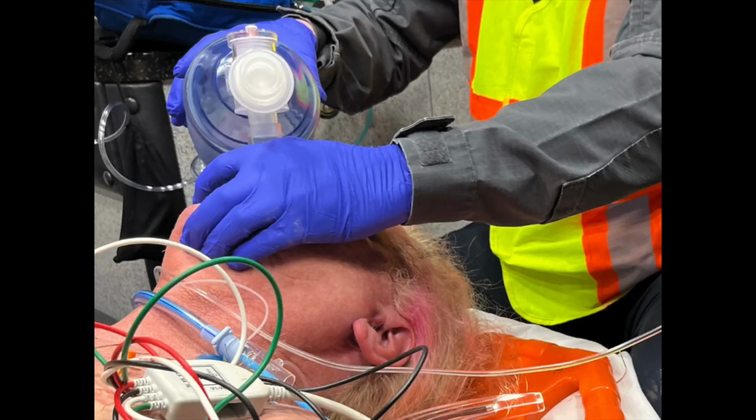Then you gotta pre-oxygenate them. 15 liters non-rebreather mask or BVM with the O2 cranked all the way up. Non-rebreather, much more preferred because the patient is taking the breaths themselves and you're going to cause gastric insufflation if you're bagging them, but do what you must to manage the patient.